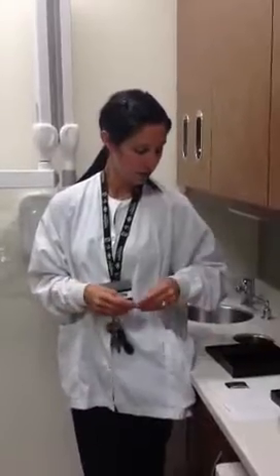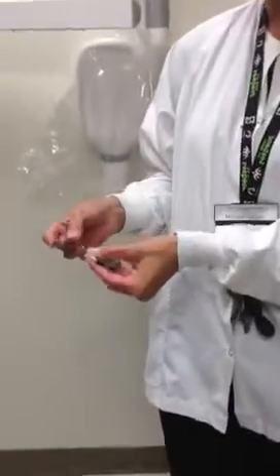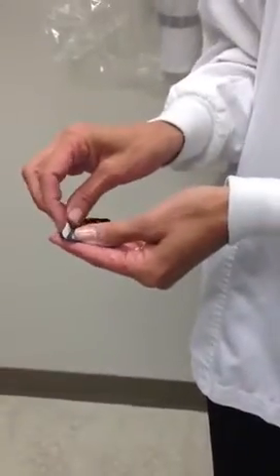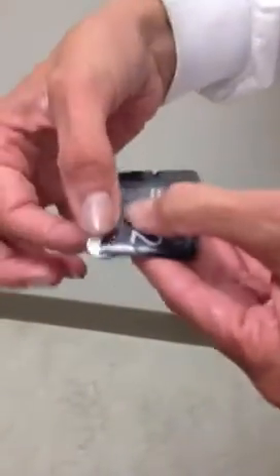We're going to walk you through the phosphor plate, so indirect digital radiography. Here are our films. We want to ensure that we're placing it into the barrier with the words and letters facing — numbers facing us, so that we can see it through the package. The A should always be where you're going to adhere and stick together this barrier.